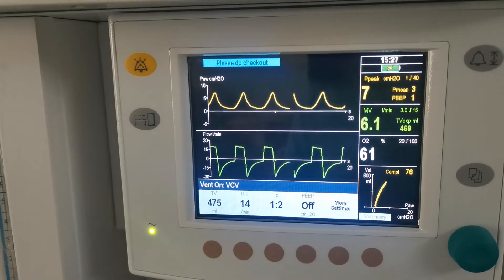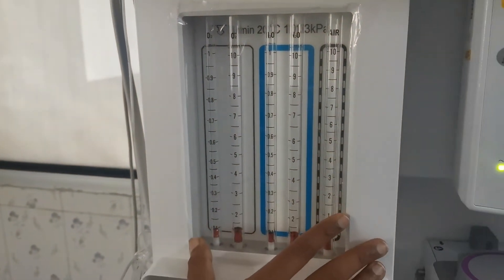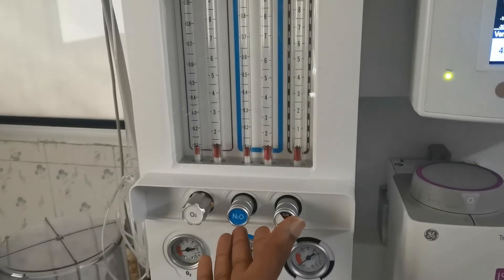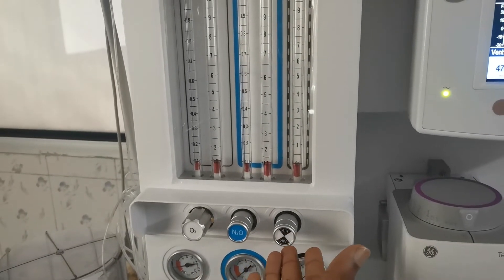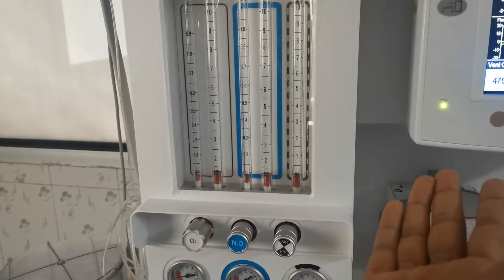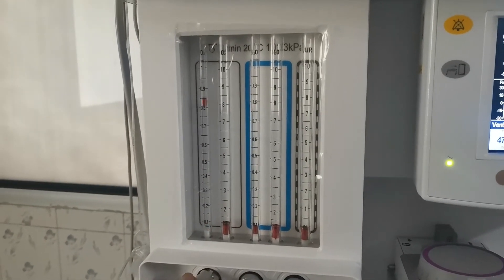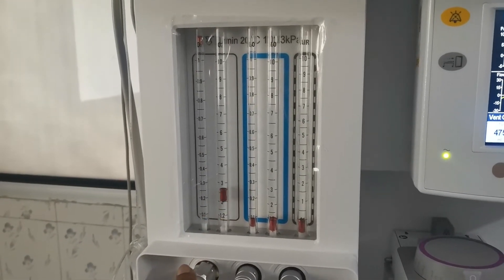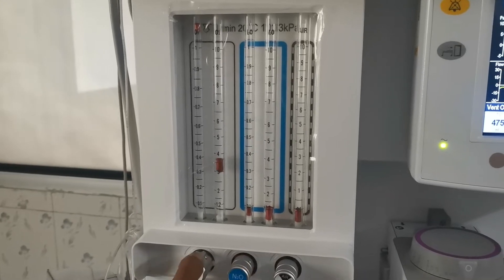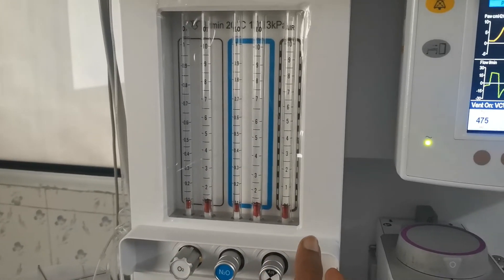Here is the fresh gas flow. You have O2 here. You can set the gases as per your requirement.